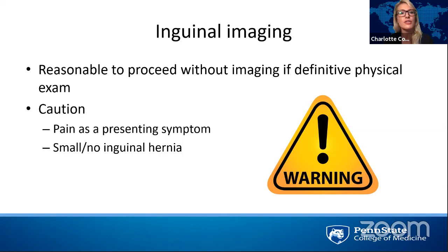So absolutely, as you're going through, it's important to read all the CT scans and not only reread what the radiology said, but also evaluate how you want to approach this, what you need to be worried about, and how you're going to counsel your patient about the repair and the outcome of their operation. That's why it's very important to physically look at all the scans that you order.